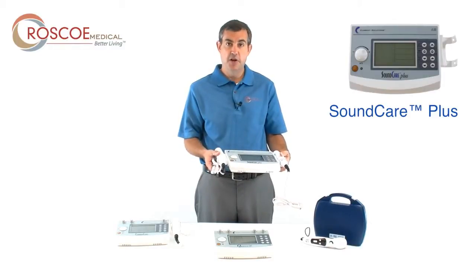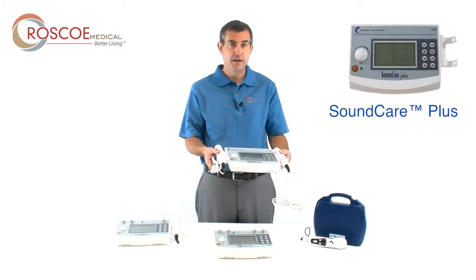What makes it truly unique is that it comes with both sound heads standard. That's very useful when you're treating a large area using a five-centimeter sound head, or a more precise area like the hand using the one-centimeter sound head. All you have to do is press one button to transfer power between both wands. That's the SoundCare Plus, and that's what makes it very unique.